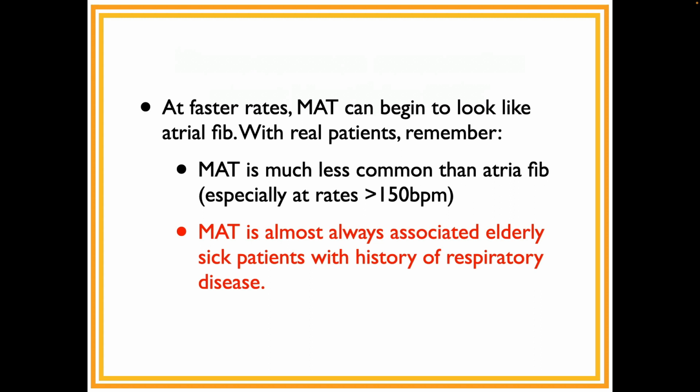For that reason, if you're in the field and you have real patients that you think might be multifocal atrial tach, that's one thing. But in this class, at those rapid rates, just assume it's AFib, because it's not fair to ask somebody to identify multifocal atrial tach without the help of the patient history. And in this class, we just look at strip after strip after strip, with no patient history. So multifocal atrial tach, unless it's like 120, will never be on the test, at least the strip.